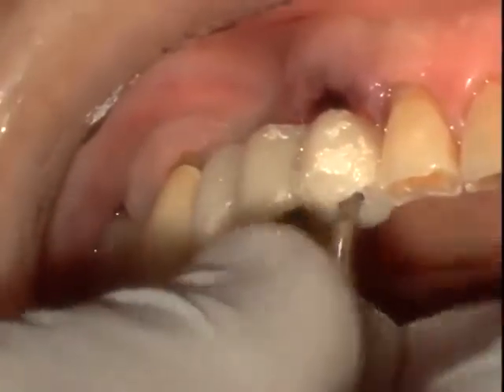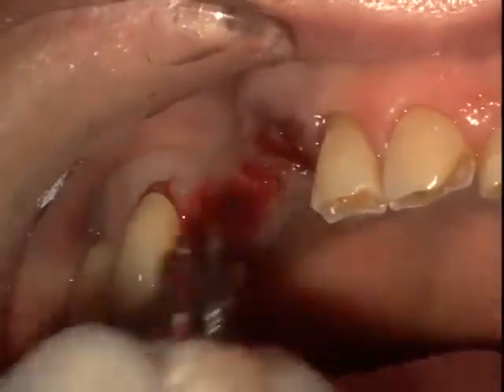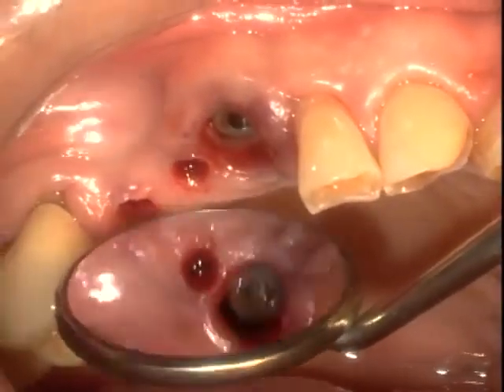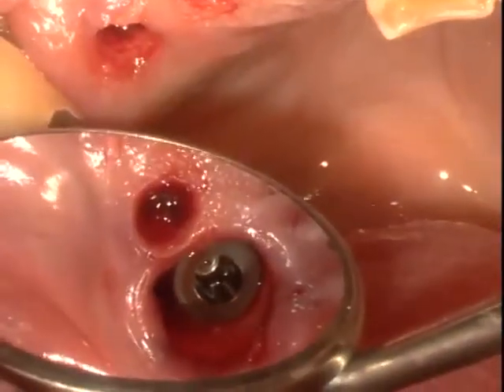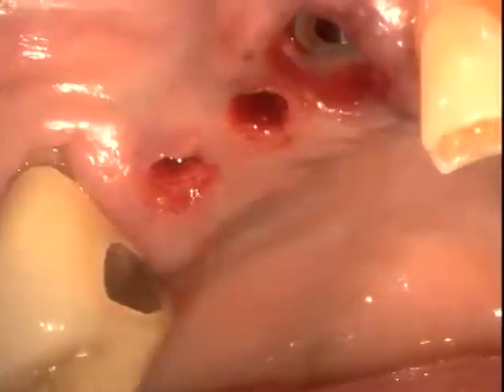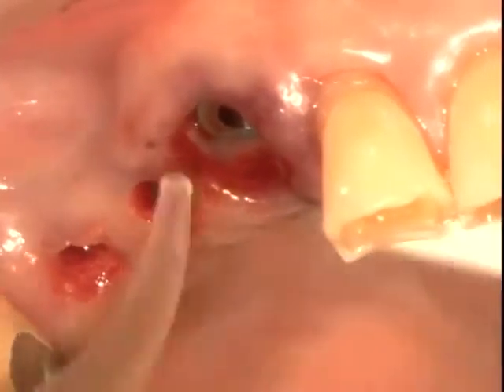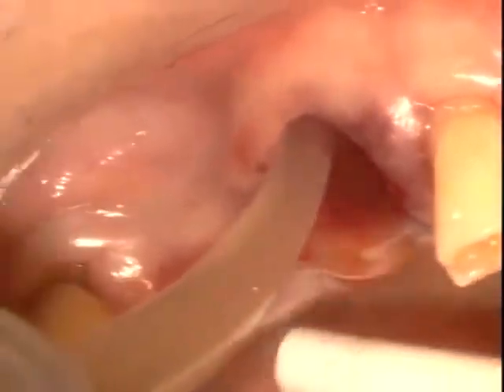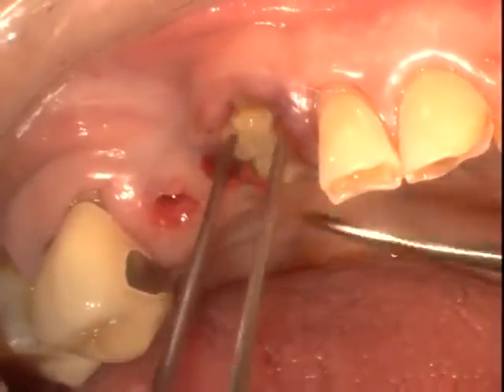We can now go ahead, and again, a procedure that was predominantly done on a computer, and now we can backfill the remaining spaces outside of the mouth as we have accurate and precise fitting of that temporary restoration to the carrier assemblies. As this is being done out of the mouth, polished and sealed in the laboratory, we're going to go ahead and complete the bone grafting on the buccal aspect of the extraction site in the area of the maxillary left canine.